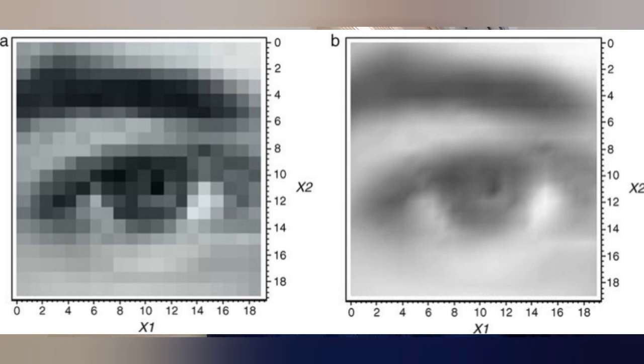Remember, contrast resolution is a contributing factor to the overall image quality. Contrast resolution is the ability of an ultrasound system to separate echoes by displaying them with different shades of gray in the grayscale. It is also called grayscale resolution. A system that has good contrast resolution is able to separate the returning echo into a wide grayscale range. A system that has poor contrast resolution assigns all the returning echoes a limited range of grayscale. Now this will result in a more contrasty black and white image.